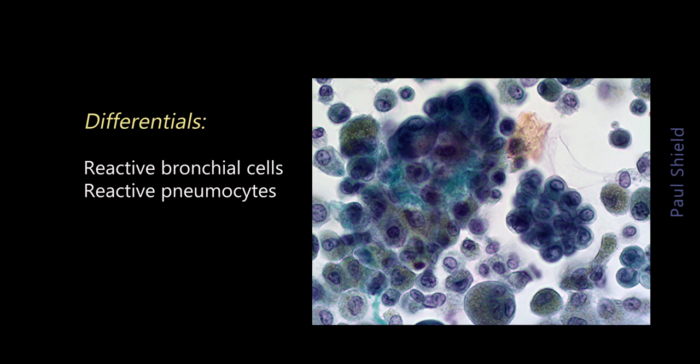These are probably more commonly seen in BALs than in sputum, and the clinical setting can be helpful in that they're usually seen in patients with a diffuse disease and in acute settings, pneumonia or pulmonary embolism with infarction or interstitial disease, so in diffuse lung diseases. And so caution really needs to be applied in patients who especially have diffuse disease and in acute settings.